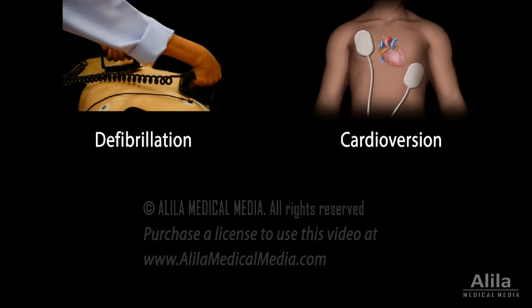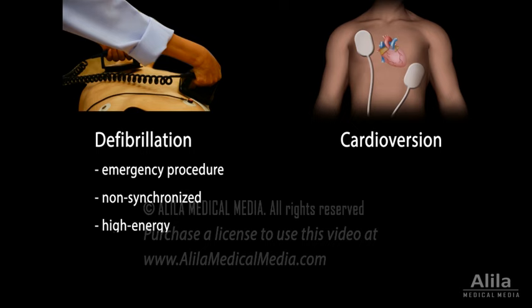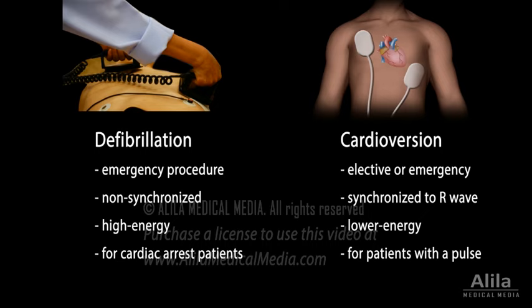Cardioversion is different from defibrillation. Defibrillation is an emergency procedure that uses non-synchronized, high-energy shocks to treat cardiac arrest patients. Cardioversion, on the other hand, is often an elective procedure delivering a lower-energy shock that is synchronized to a certain stage of the cardiac cycle.